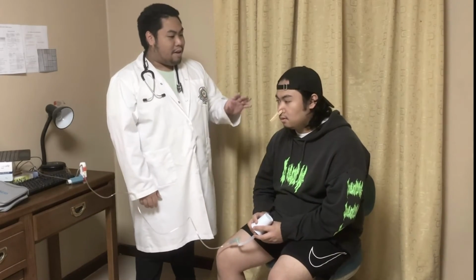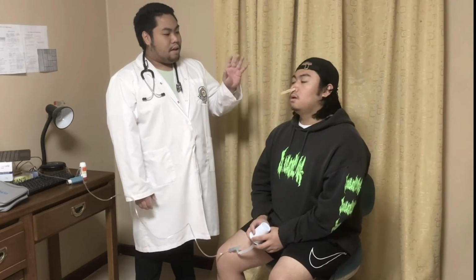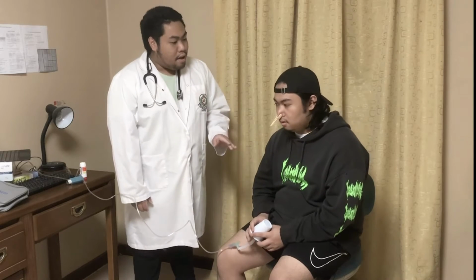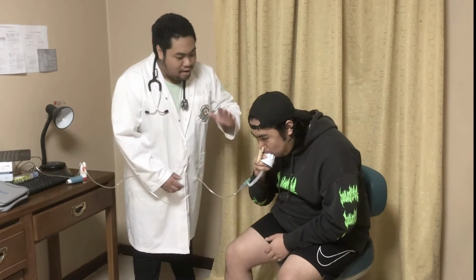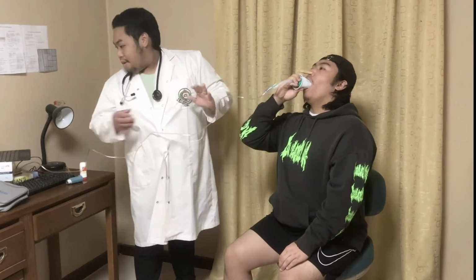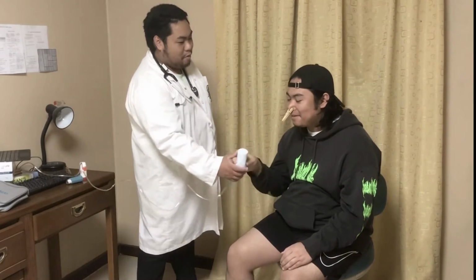Inhale. Exhale. Inhale. Exhale. Inhale. Exhale. Inhale. Exhale, exhale, exhale, exhale, exhale, blow. Inhale. Okay, that's good, sir. It's time to take it out, sir. How are you feeling, sir?